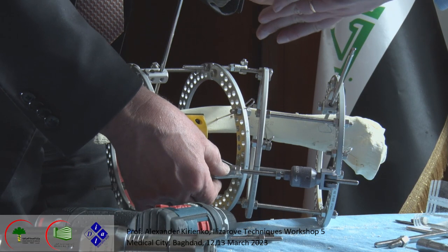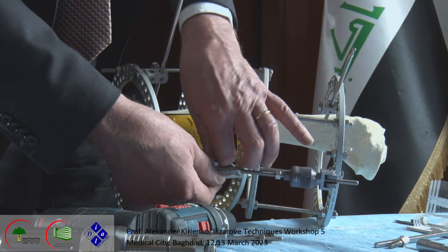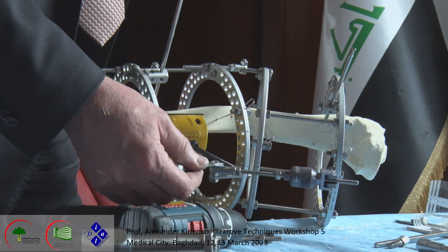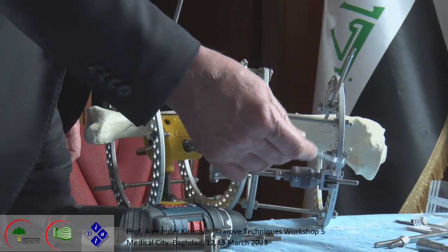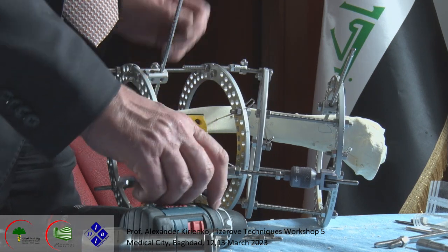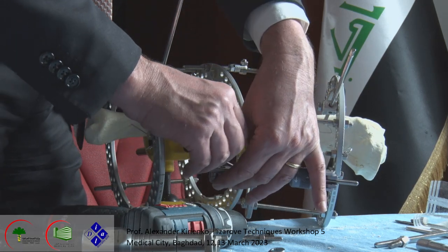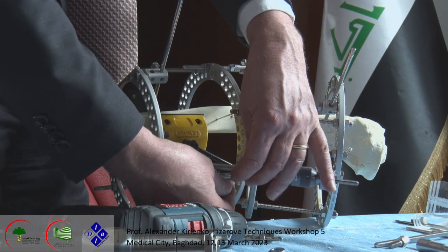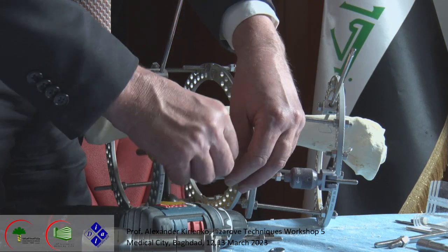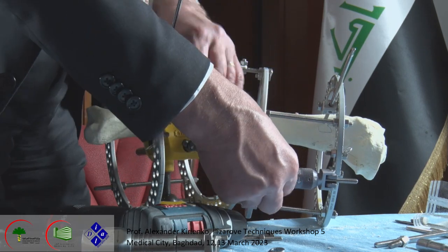Why we create this system? Because this system permits progressive correction, and we have in this system two hinges, one distal, one proximal, here and here. In this way it is adapted really easily. I am only afraid that this will touch here, and for this reason I should put the hinges differently, because we do the correction and after that the rod touches it. Better that we displace it again like this, lateralize it in this way.